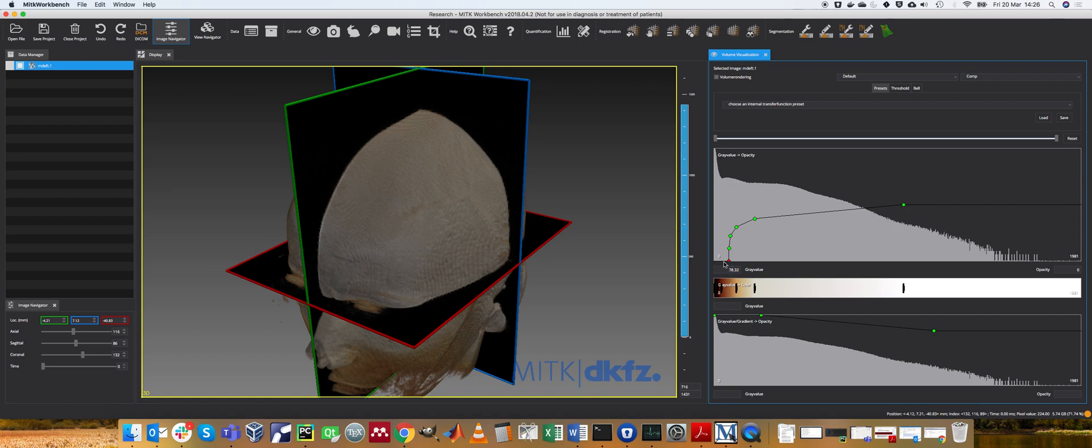So values below 78 are mapped to an opacity of zero so they disappear, and then as you go along this graph, so the opacity changes.